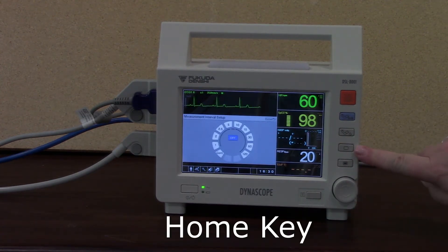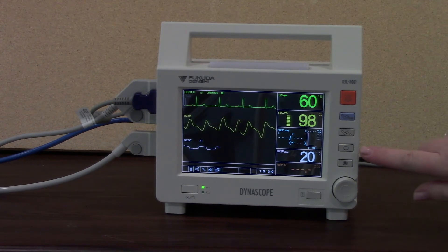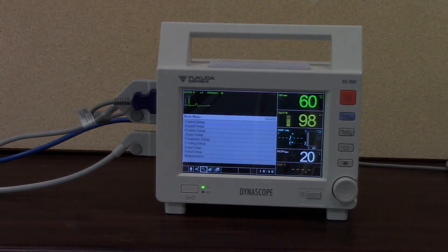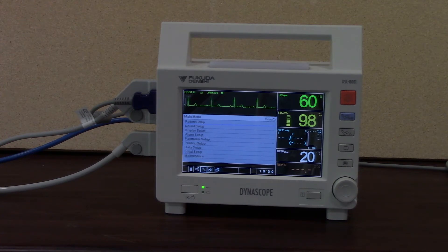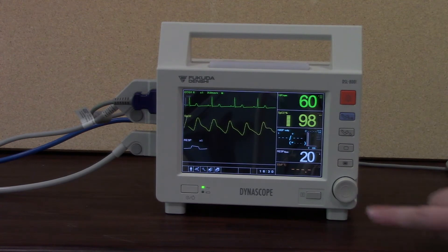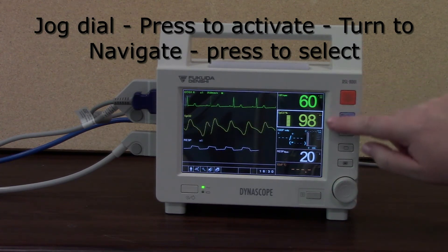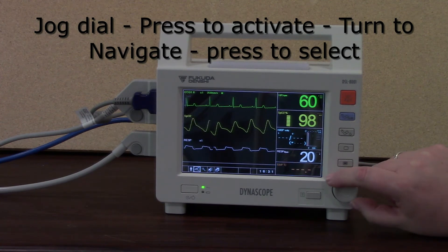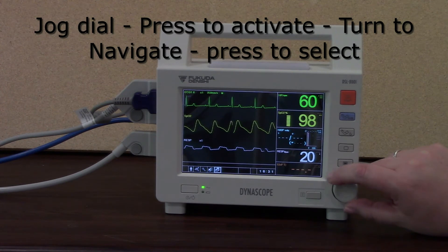I've got my home key right underneath. If I press the home key, that will clear whatever's on the screen. No matter what windows or menus I have open, I can get back to my monitoring screen quickly by pressing that home key. Just below that is my menu key, where I can do all sorts of patient setup, alarm setup, and sound setup functions. The jog dial allows me to navigate around the screen — you press to activate it, and then you can see in white it highlights around each parameter: SPO2, NIBP, RESP, TEMP, moving along the bottom, highlighting each area and function within the monitor.